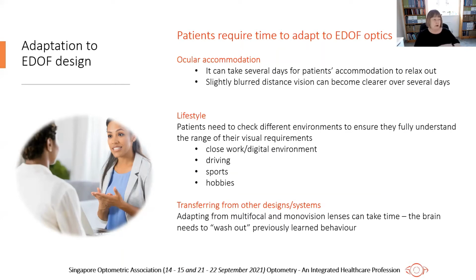So that means any hobbies, driving, golfing, any long distance events they do, looking at the phone, looking at the watch, looking at tablets, reading in their own environment at home, which may have dimmer or lighter light than you have in your office. So you need them to go through that full range of experiences to make sure they're not going to take the lenses away and then come back complaining a week later because it doesn't do X, Y, Z.